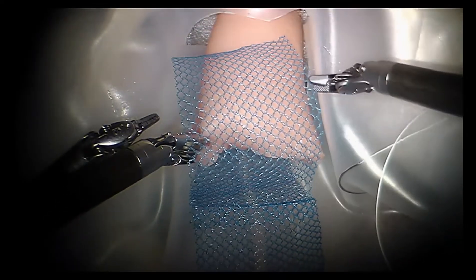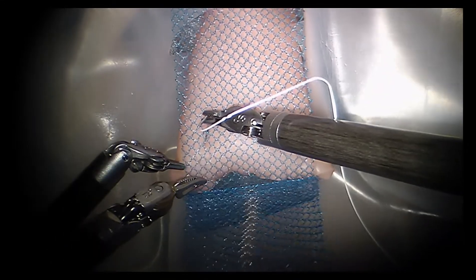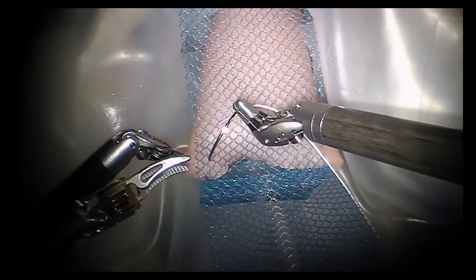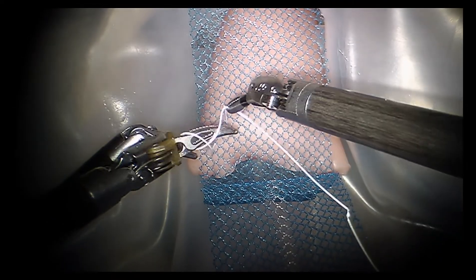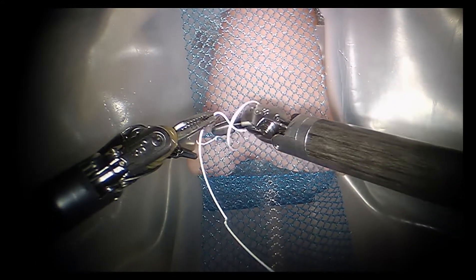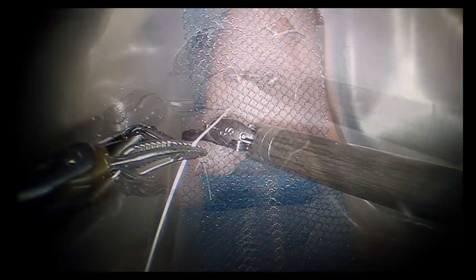Due to limitations of the model, there was no opportunity to simulate the vesicovaginal or rectovaginal dissection. Here, you can see that the mesh was trimmed to the proper length and placed into the surgical field. Several interrupted sutures are placed on the anterior vaginal wall. This model does not allow for placement of a vaginal manipulator, and that portion of the procedure, therefore, cannot be simulated.